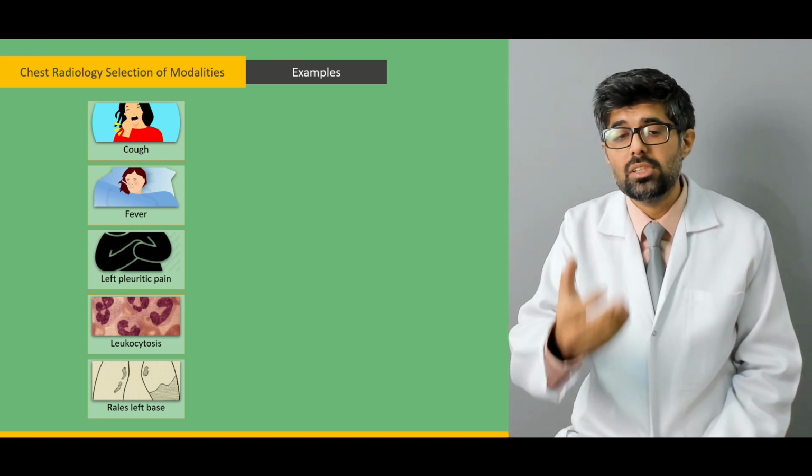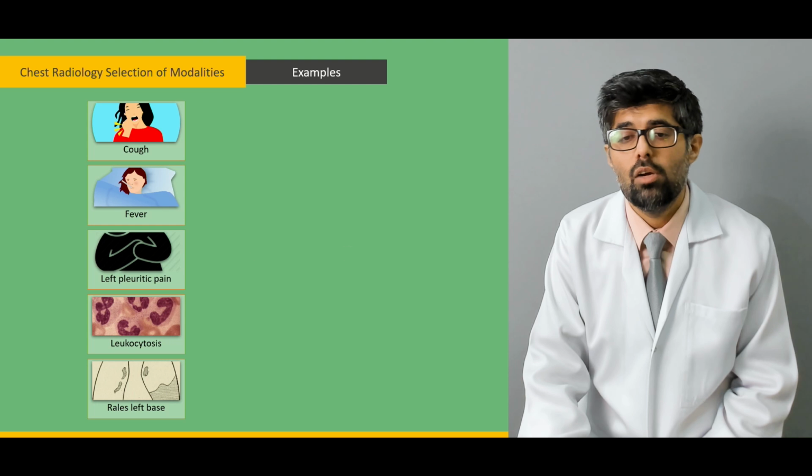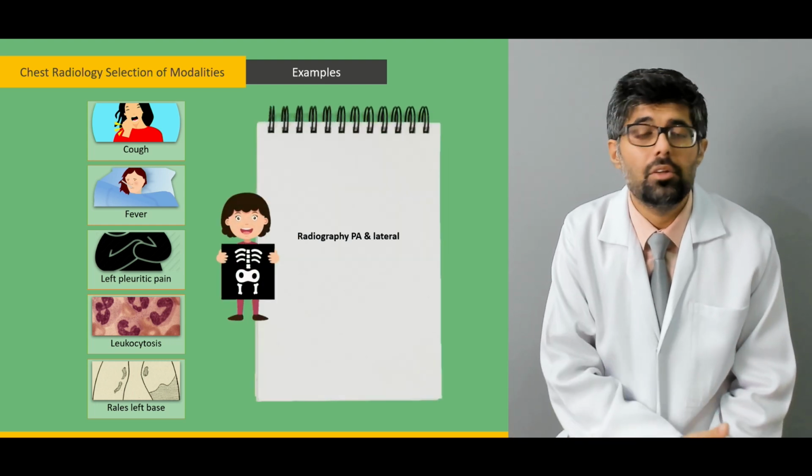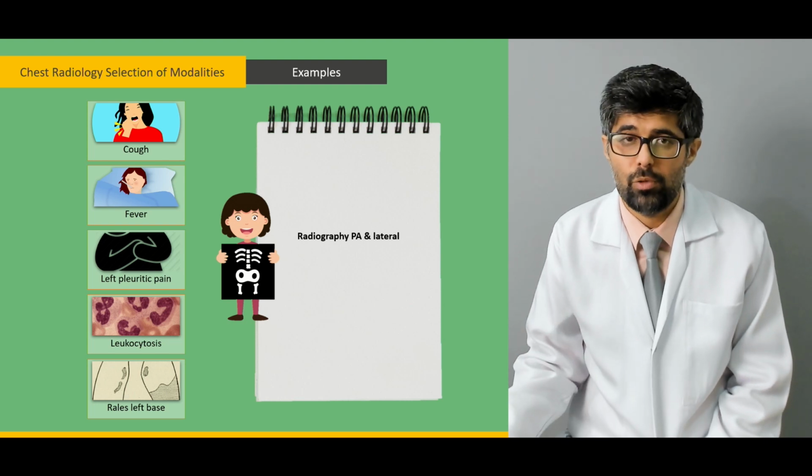If the patient presents with these symptoms, we usually go for the normal x-ray, either in the PA view or the lateral view.